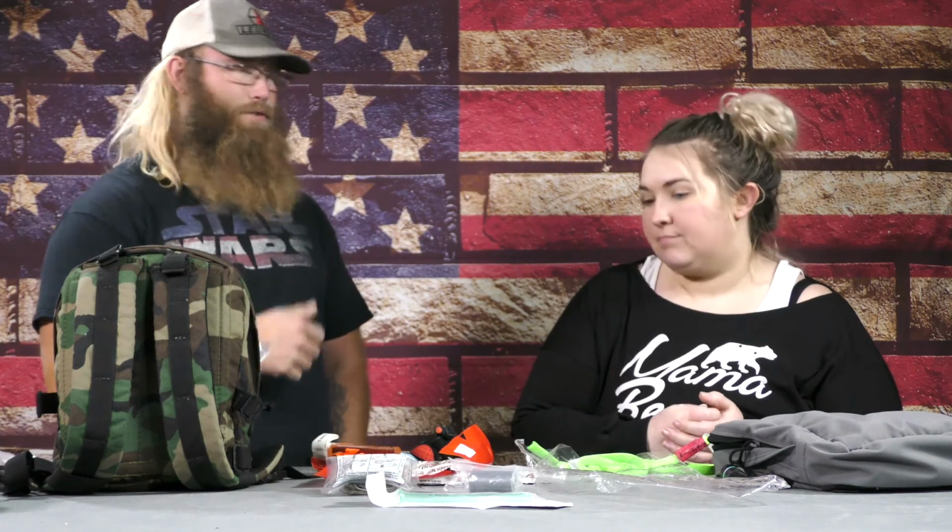Yeah. All right, cool. So that's the VOK. There's also a pocket VOK. The pocket VOK is everything in the VOK except the H bandage and the NPA. Oh, okay, sweet. And like you said, you can do a lot of that stuff with T-shirts and sweatshirts.